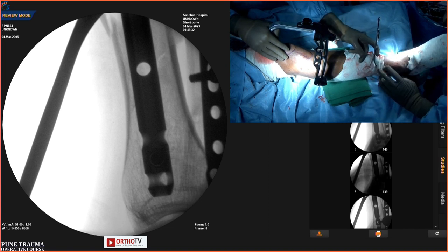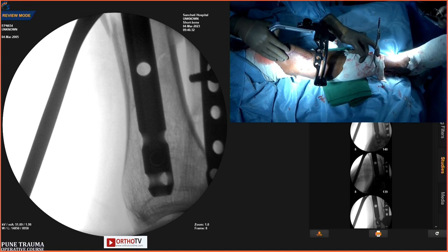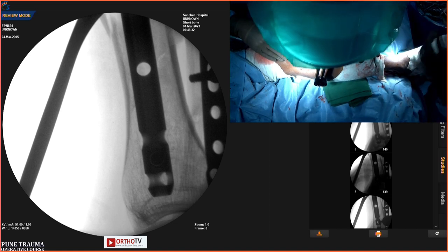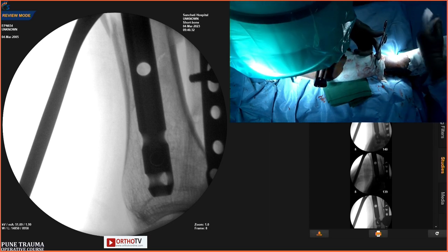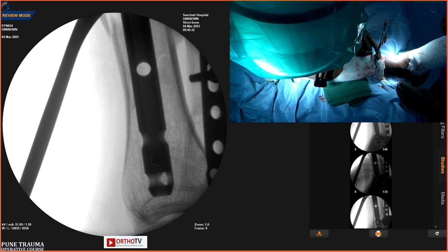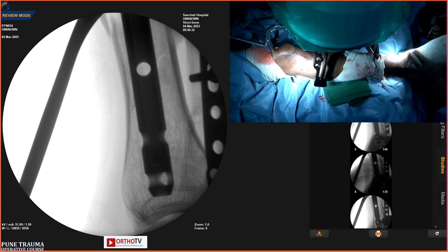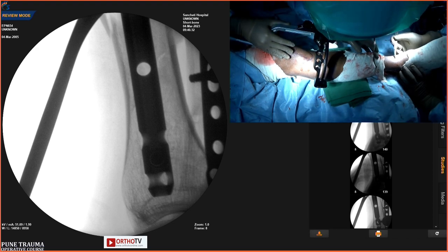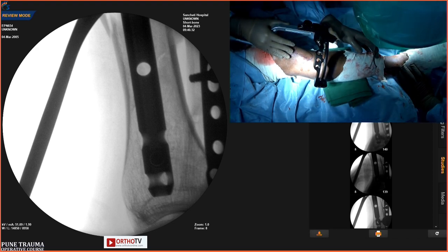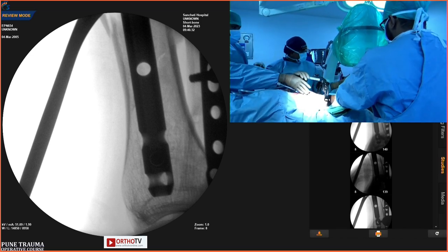Atul, Shiva, I am happy you started this. For a distal tibia, you don't have to really potentially damage the patella and everything. You will be able to get the same job done the way you are talking about. Sir, Shiva, sir, in this particular case, for demonstration purpose it is okay. We wanted to show delegates a suprapatellar.